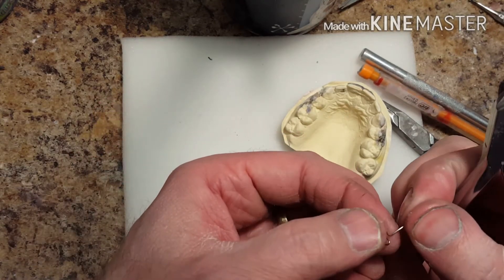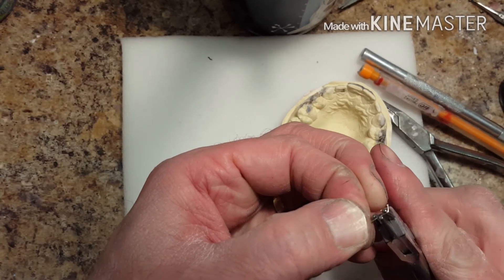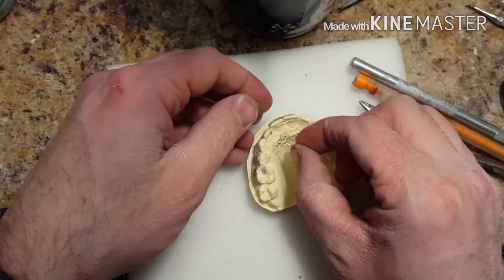Once the spring is where it should be, you're going to put little bends in it just to give the acrylic something to bond to a little bit better. That's what I'm doing — just making a few little bends in it.